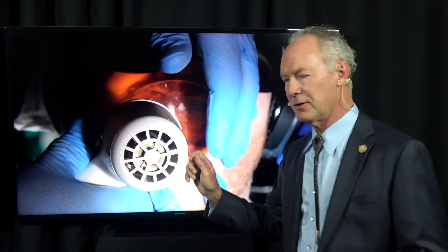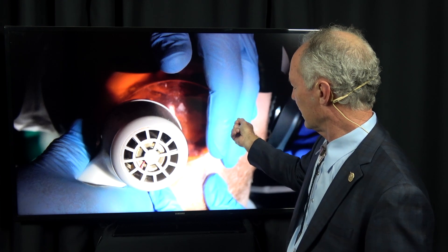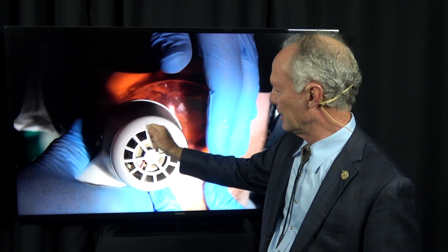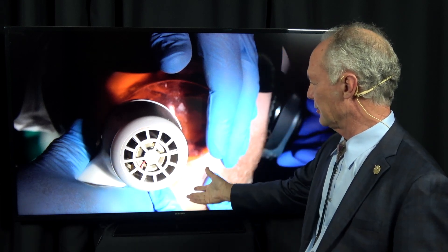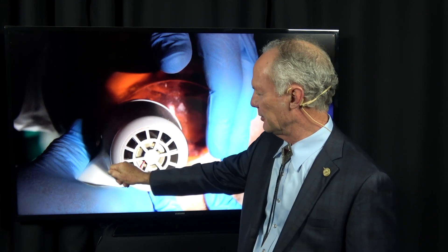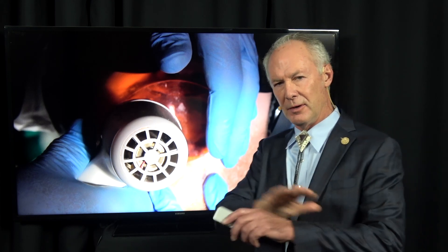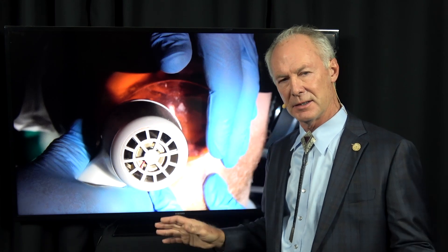At this point I take a curing light and cure them very briefly — about a second or two on the palatal and the same on the facial. The luting composite is set kind of like crunchy snow, because you never want to remove the excess luting composite in the unset stage. You don't ever want to wipe it off — you want it to break off. Otherwise, if you wipe it off, you're going to get some suck back in that micro gap between the veneer and the tooth.